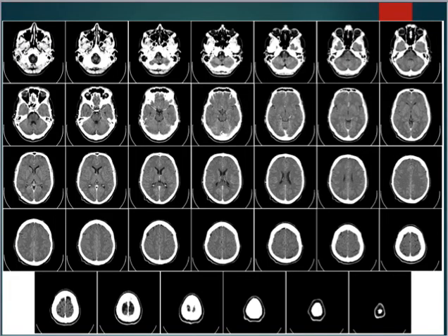This is a layout of all of the different slices. As you can see here, from the base of the skull, you've got the foramen magnum here, all the way up to the very top of the skull cap, and all of the images and slices in between. This is another way that we can lay them out to look at the images individually. A lot of times what the radiologists do is they have a whole image and they can scan through it. There are some of those on JetNet, so you can go through and actually scroll through the images so that you can see them.